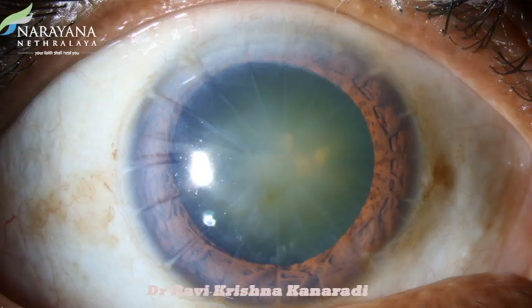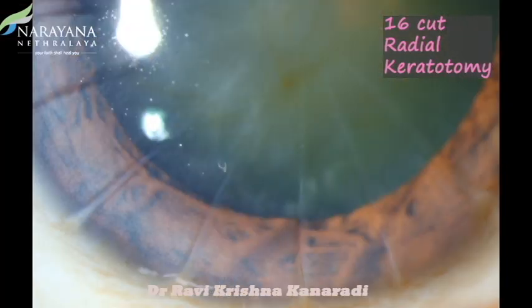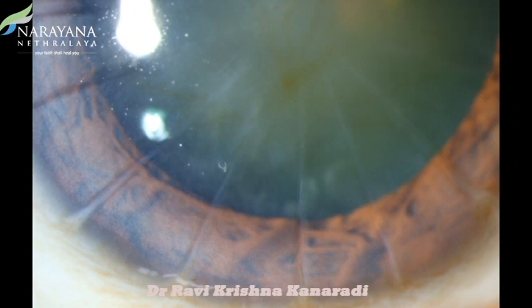A 66-year-old gentleman who had undergone a 16-cut RK presented to us with cataract in his right eye. The 16 radial lines are very deep at 90% depth.